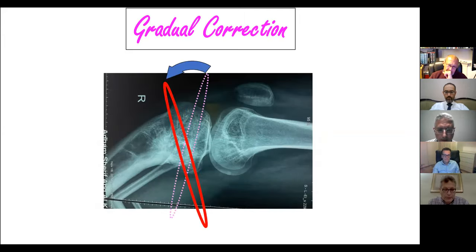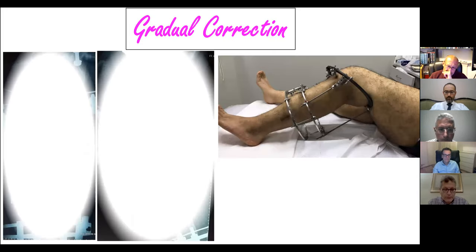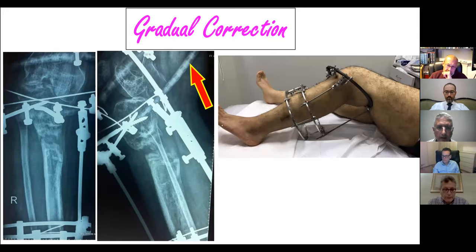This is the practical example of the same case. As we see here, the ring impinges on the back of the thigh. In these cases, I prefer to use carbon fiber rings to allow for modifications. So in this situation, we have different solutions. The first is to leave it. However, we cannot leave it actually because the deformity is not yet corrected. We still have varus here and the tibial slope is not yet corrected. And we still have internal tibial torsion to be corrected.